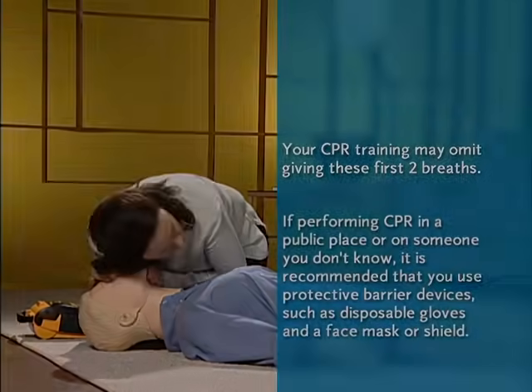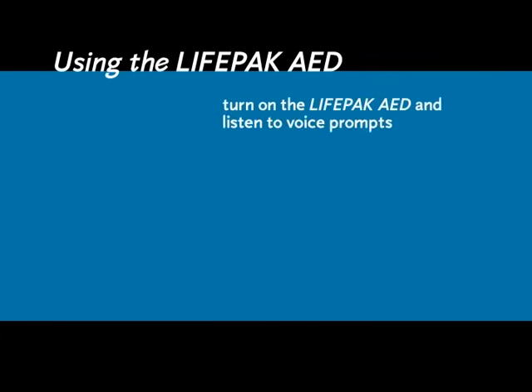Now it's time to use your AED. Using the LifePak AED is easy. I'll give you a quick overview, and then we'll go through it again. Turn on the LifePak AED and listen carefully to the voice from the device. It tells you what to do.